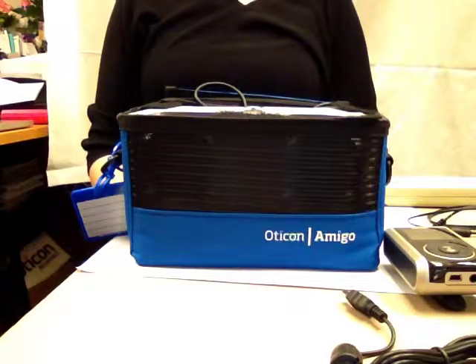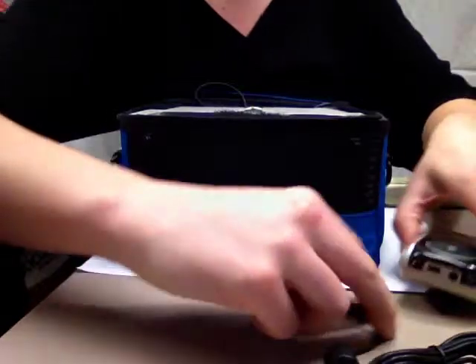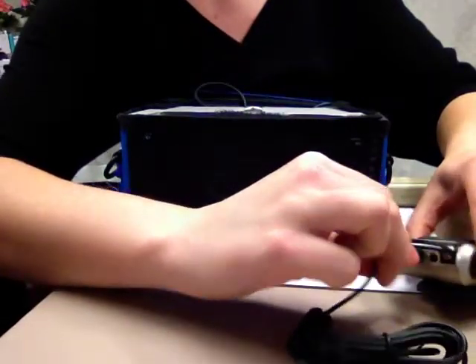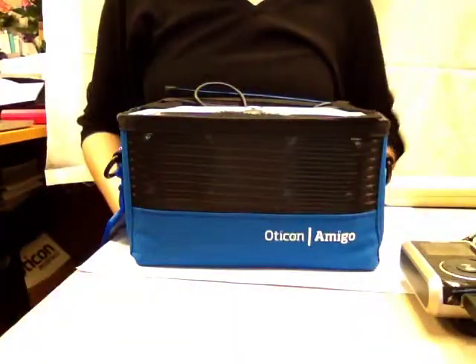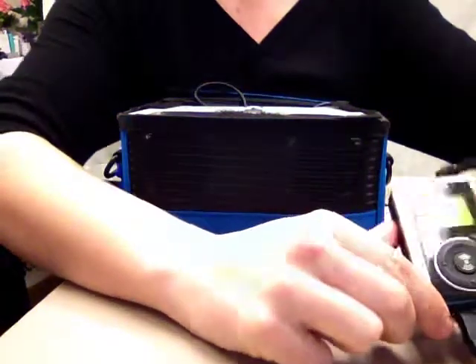When the equipment is not being used, it should be taken to the classroom and charged. The following steps should be used. Turn off the Oticon T20 transmitter. Connect the charging cord into the port on the transmitter's bottom, and then of course the other side into a wall socket. The Oticon T20 transmitter must be in the off position to charge properly.